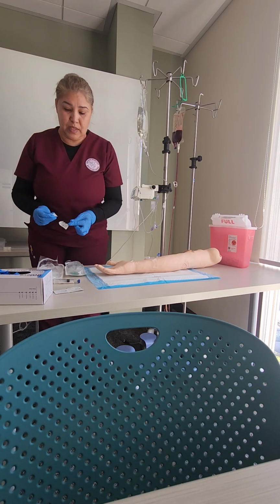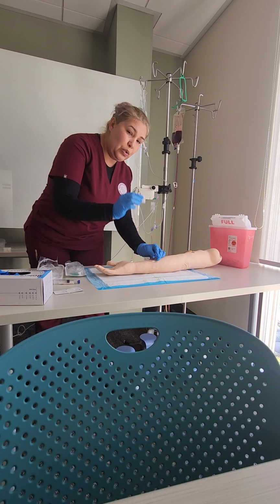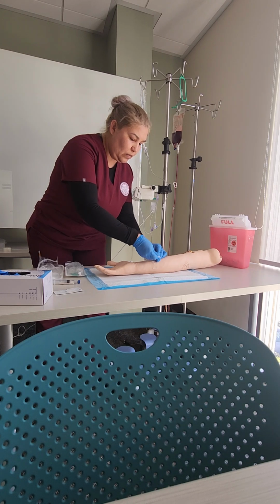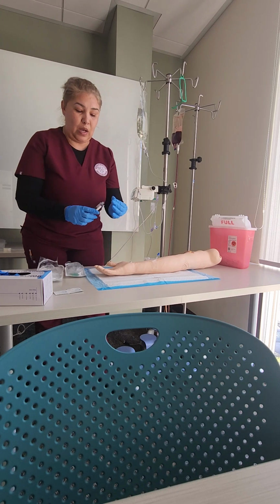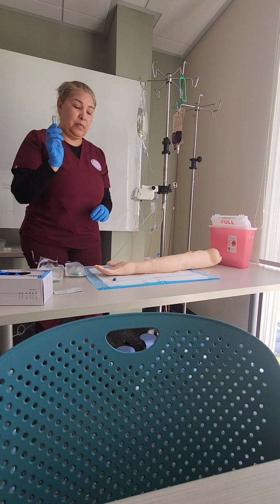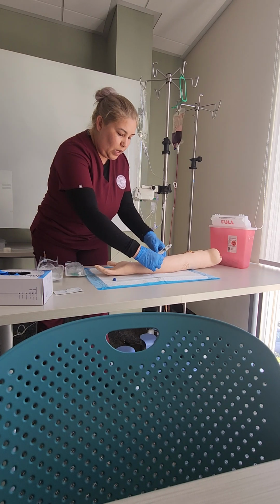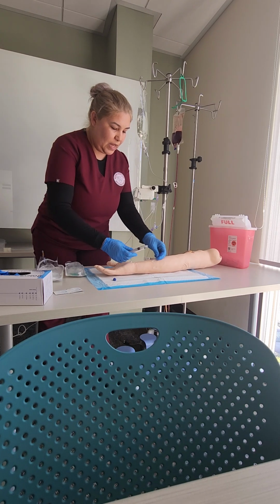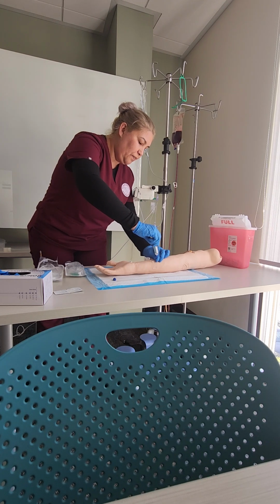So what I want to do is make sure that I come to the IV site. I'm going to clean the hub for 30 seconds. After I have cleaned the hub for 30 seconds, I'm going to go ahead and prime. Okay, I've primed the saline that I'm going to flush with. And now I'm going to insert it.